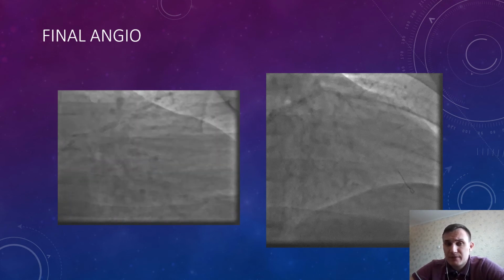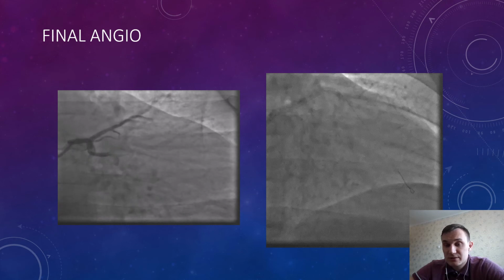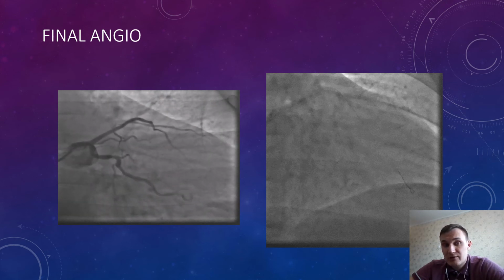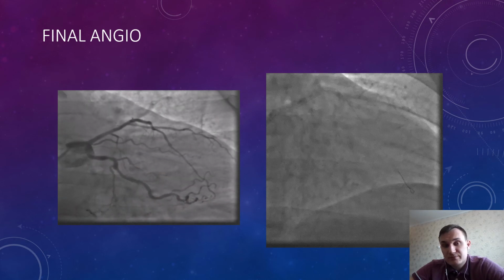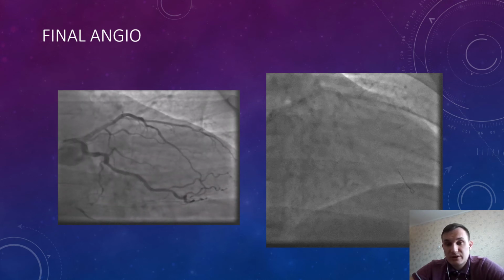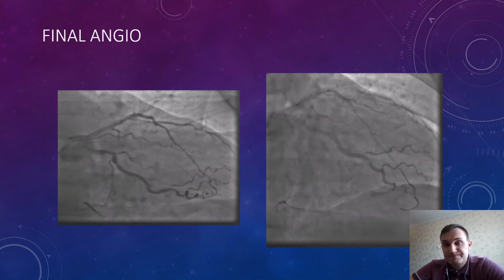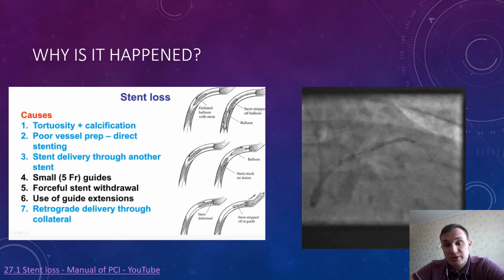But in this situation, it was the only decision to do kind of caging of the previously lost stent, and however, it is not so bad a decision. But again, I should say that life is not always perfect, and this case is illustrating this suggestion.